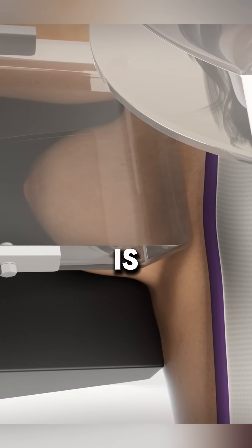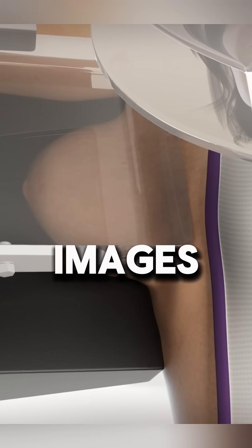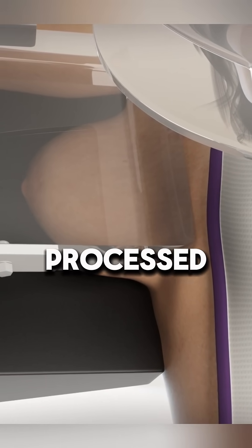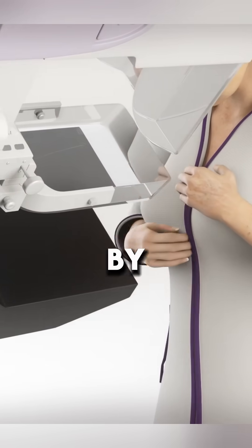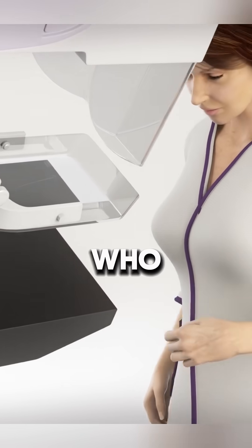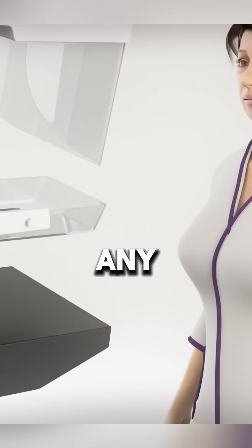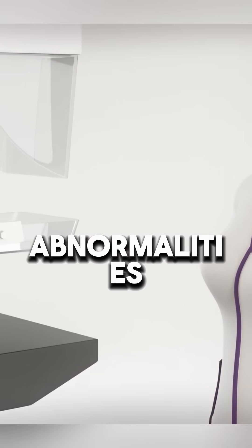Once the procedure is done, the images are processed and reviewed by a doctor who looks for any abnormalities.